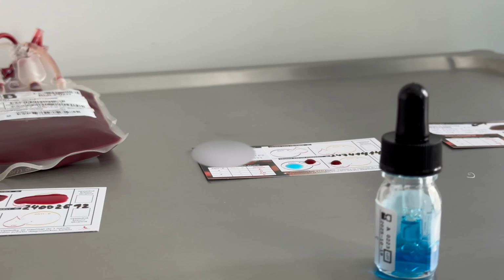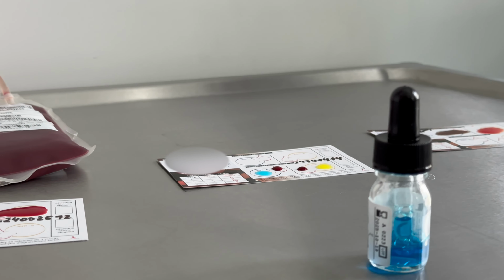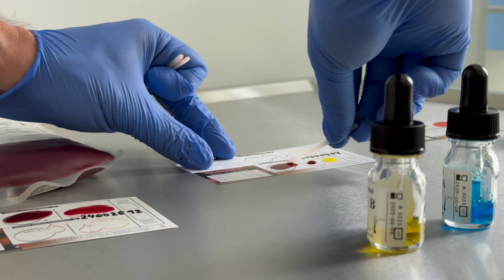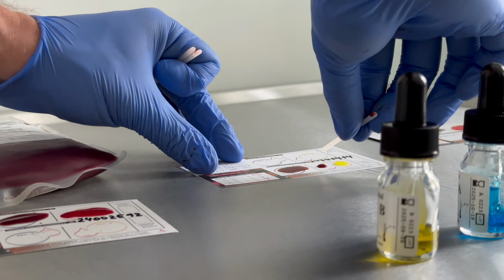Both cards have designated areas where the blood is mixed with reagents containing anti-A or anti-B antibodies. The physician observes whether agglutination, clumping occurs in the individual fields on the cards and verifies that the patient's blood type and the blood type of the transfusion product are compatible within the ABO system.